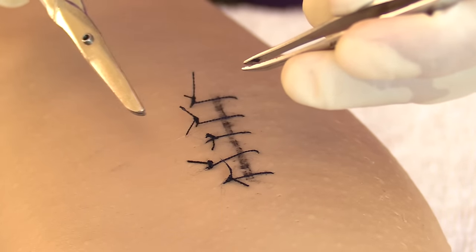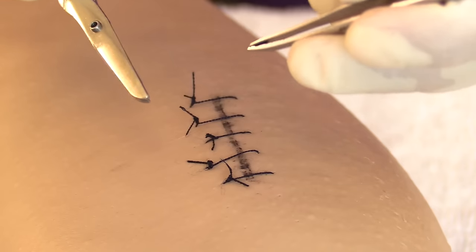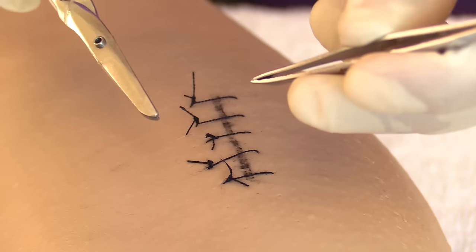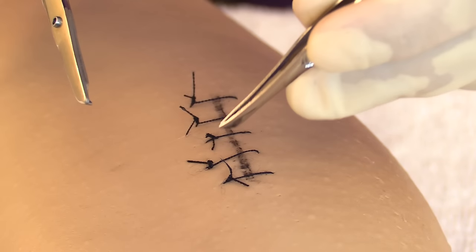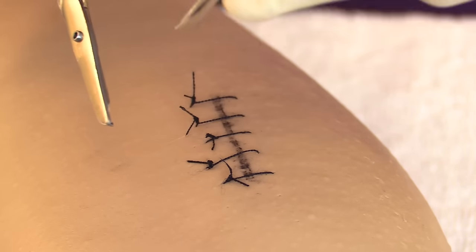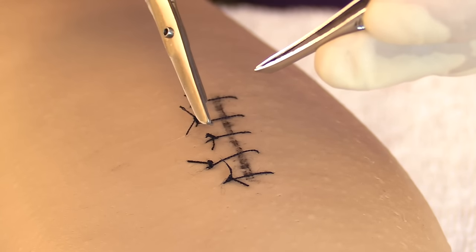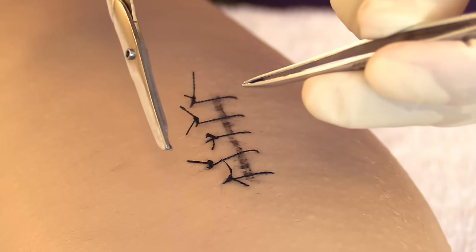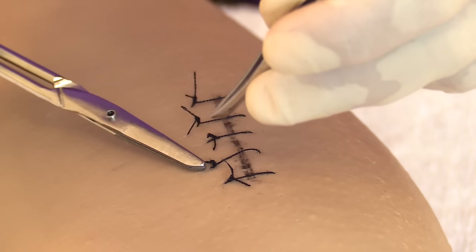After removing every other suture, apply steri-strips before removing the remaining ones to further reinforce the wound. An important point to remember: where you cut the suture thread matters. Do not cut on the far side of the knot — if you do, when you pull the knot out, that portion of the thread that's been exposed to the outside environment will slide underneath the wound, introducing germs and risking infection. Always cut on the side of the knot closest to the skin.